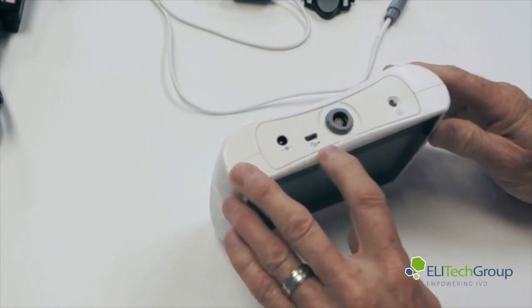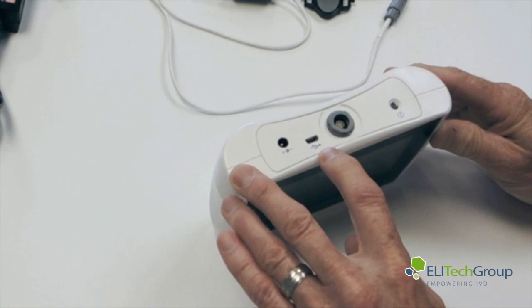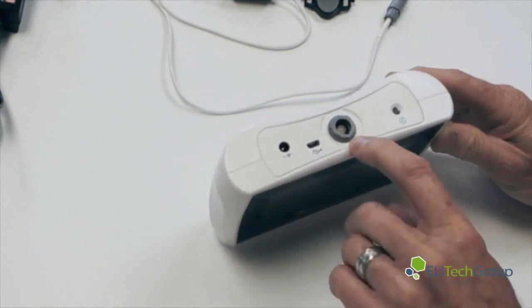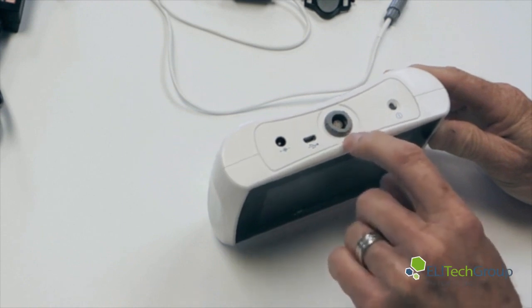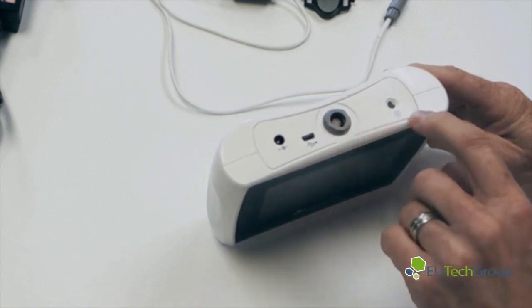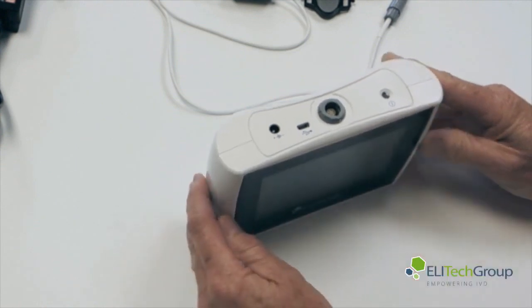There is a USB port for exporting the data to a computer or to a flash drive. There is a connector for your electrode set, and there is a power button, which is used to turn the device on and off.